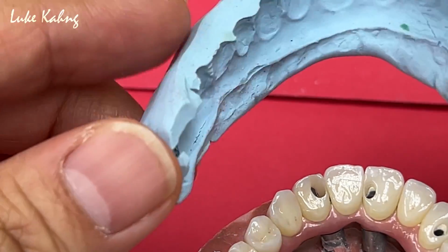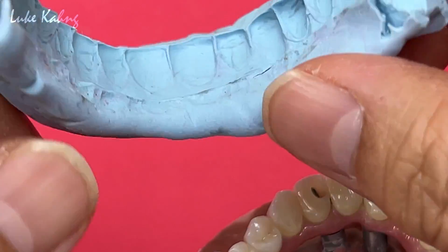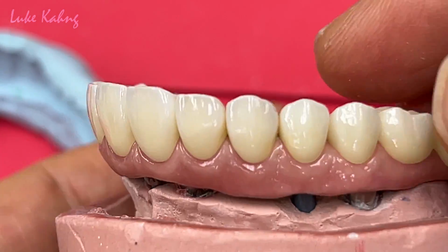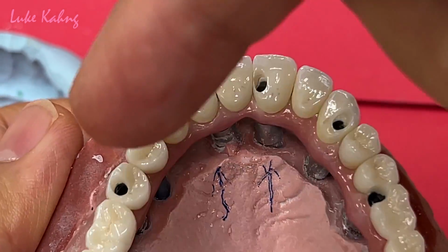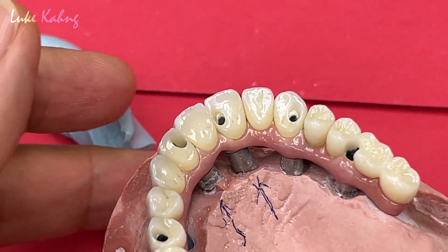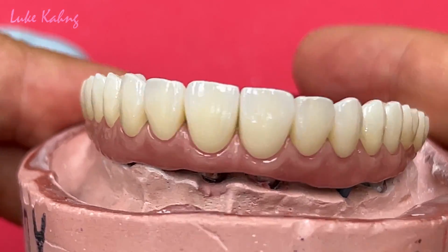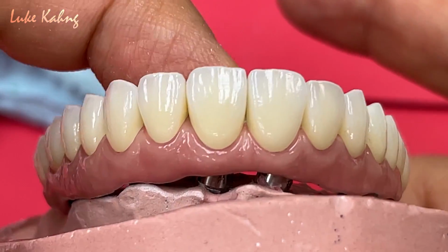Then all fabricated from the putty, the UCLA techniques. All accomplished that one. So all zirconia ceramic. Then we protect the occlusion as well. So now it's just cementing time. It's a long journey. All right.